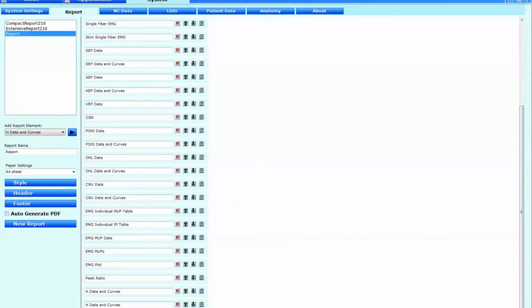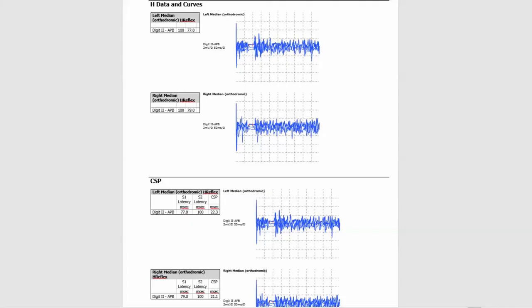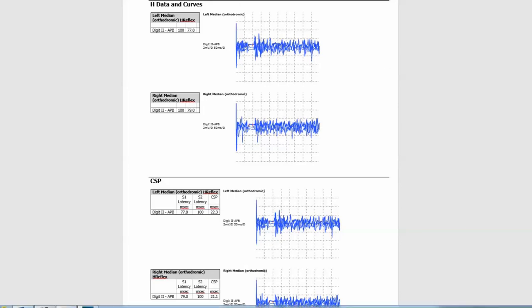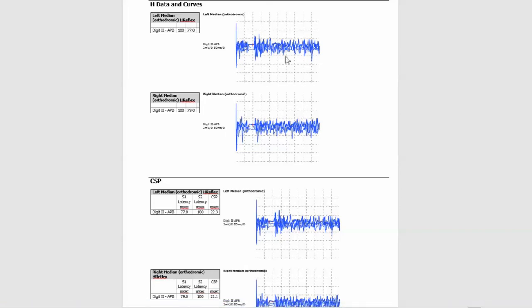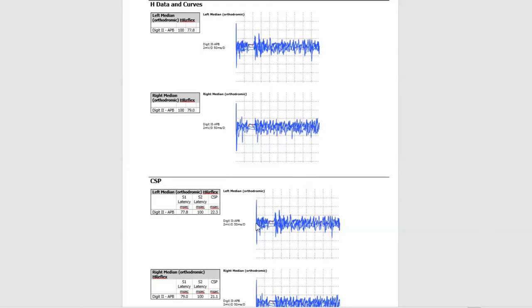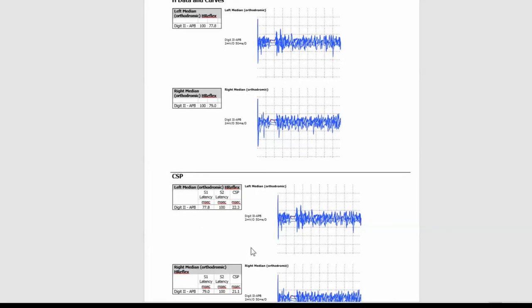Also, you have to change that on the report element there as well, just so you know which one's which. Let's now check through what the report will look like. And just to highlight an important point here. Because we have effectively used the H reflex to record the cutaneous silent period, it's now going to appear twice in our report. Firstly, under its own H data and curves. And secondly, under its own heading of CSP. If you carefully note as well, you can see the changes that we've enacted here to the cutaneous silent period. We have the S1 latency, the S2 latency and the cutaneous silent period here, all labelled very nicely.